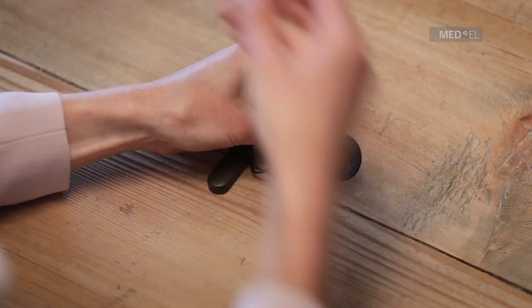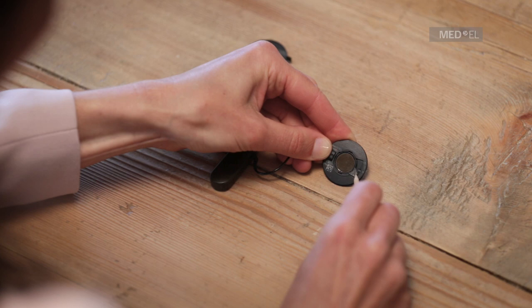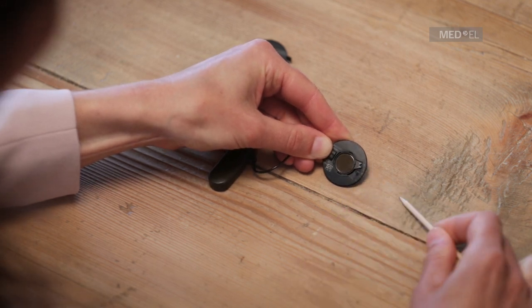Use a ballpoint pen to lock the coil in the plus position to strengthen or minus position to soften the attraction of the magnet.